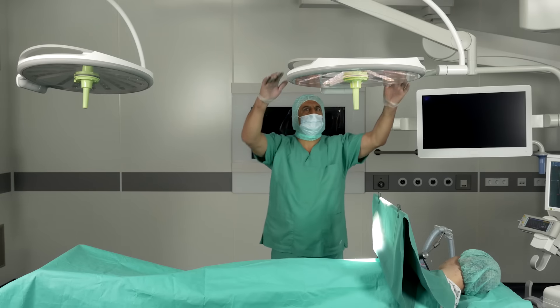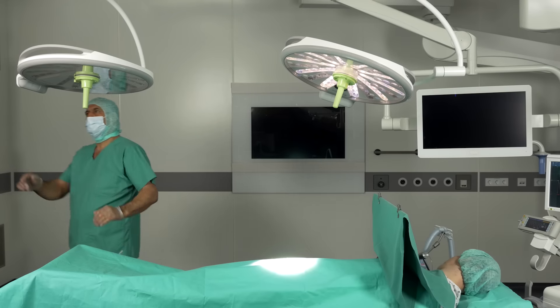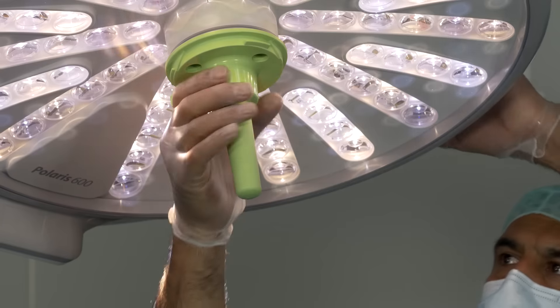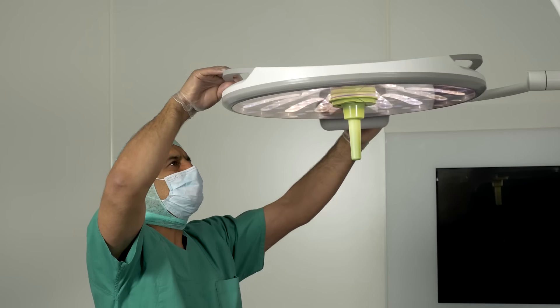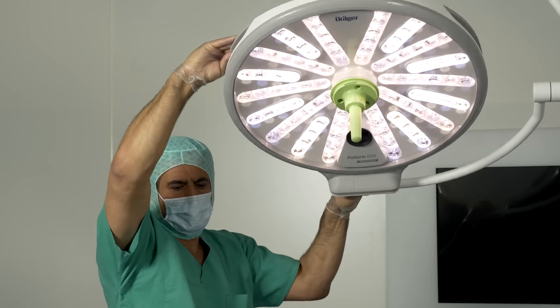The slim robust light head and the classic round design of the integrated hand grip makes use very convenient. Its high degree of maneuverability in all directions means that illumination can be brought into any position wherever it is required.